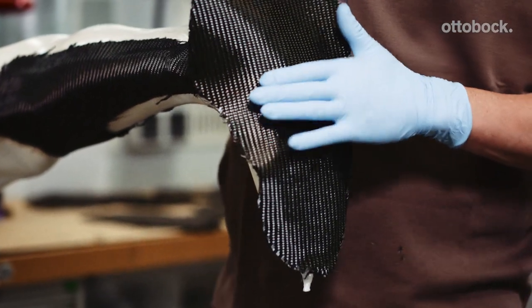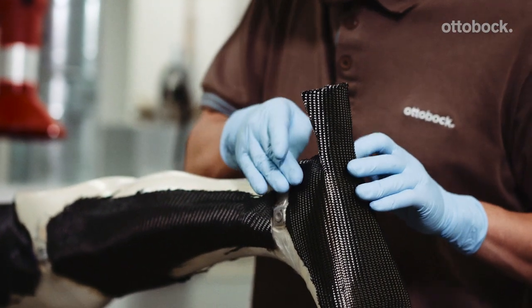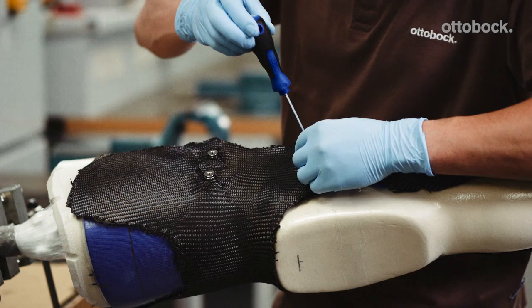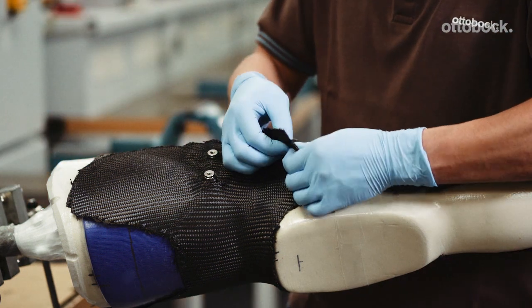The first layer on the foot compartment should have a 45 degree fiber direction. The second complete layer for the thigh and lower leg follows with a 45 degree fiber direction.